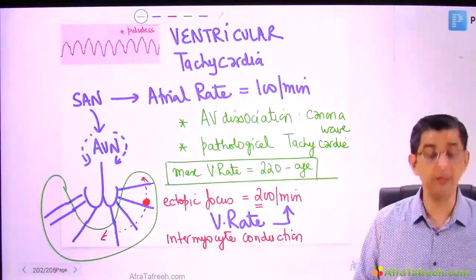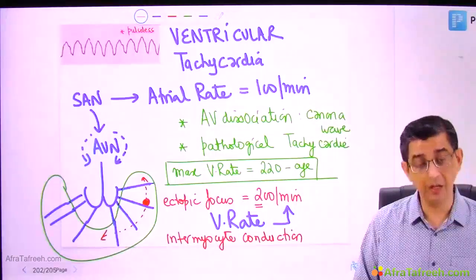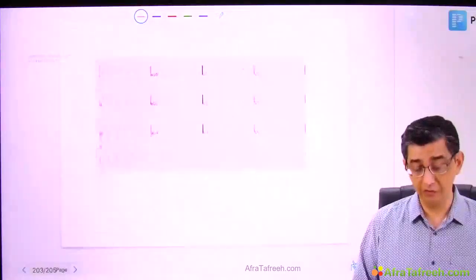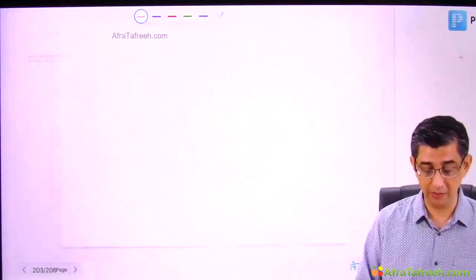Unfortunately, though we had treated this MI case with thrombolysis or PCI in the stipulated duration, this patient can deteriorate and can actually die. So let us now look at what can be done for management of these patients. First and foremost, I can hand draw a rhythm here before you, before I actually comment on the real-time ECG of the person.